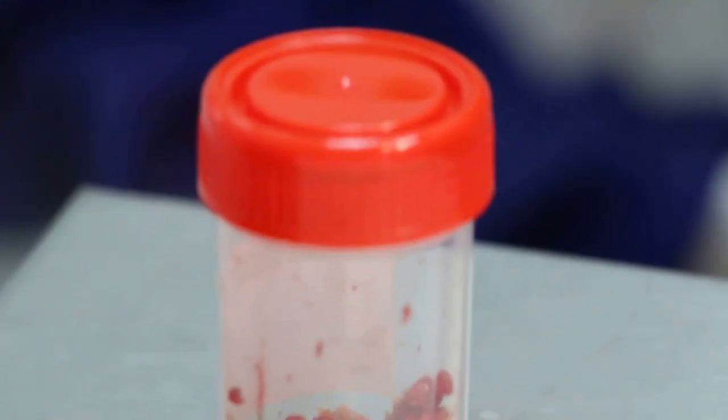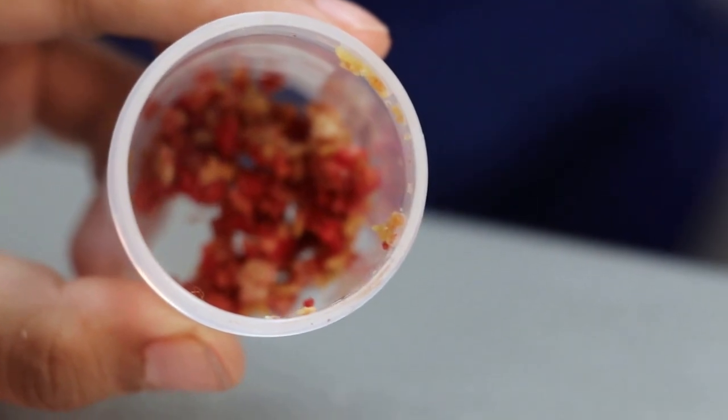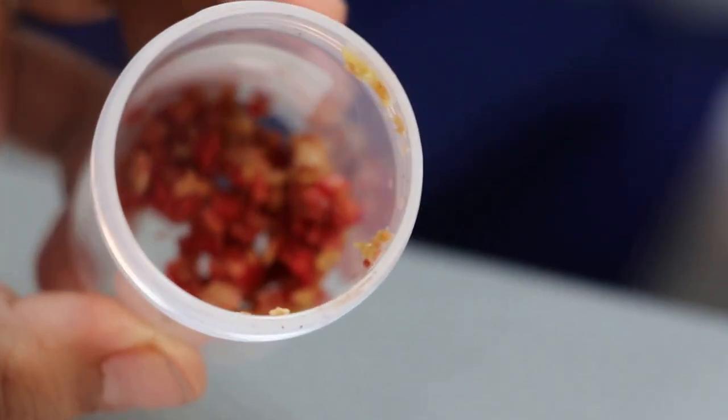Closing up — then the bladder stone open first. The bladder stone looks very much like calcium oxalate or urate.